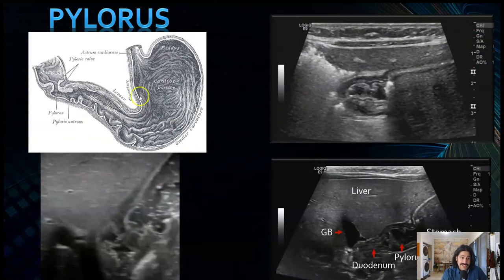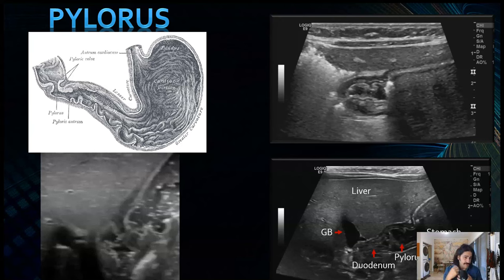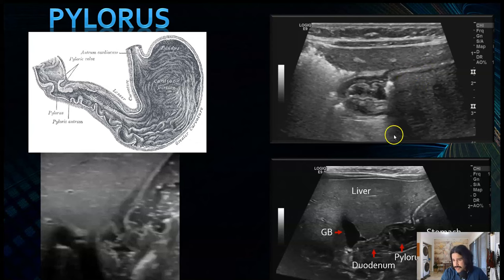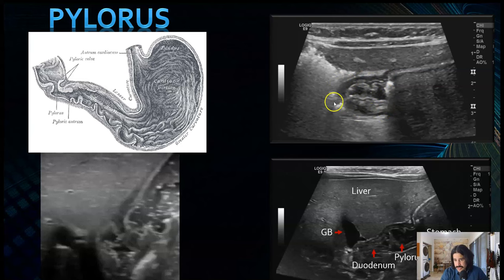The pylorus is the end of the stomach — you have the antrum, the pyloric antrum, and then the pylorus, which is a sphincter. So you have the esophageal sphincter and pyloric sphincter. It's a circular muscular ring that keeps stomach contents in long enough for digestive enzymes to start working, then propels food toward the first part of the duodenum. Here's the antrum — there's a lot of air, so you can see dirty shadowing. Then the pylorus, the pyloric antrum, the pyloric sphincter, and the first part of the duodenum. This is a normal pylorus with some liquid and air.